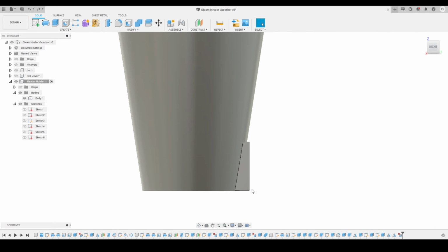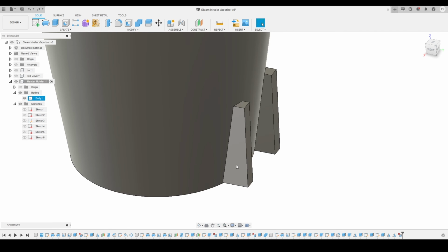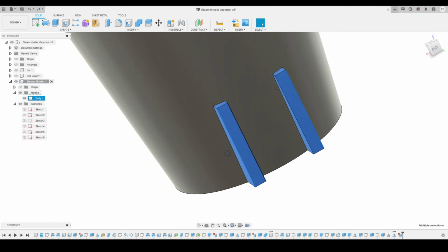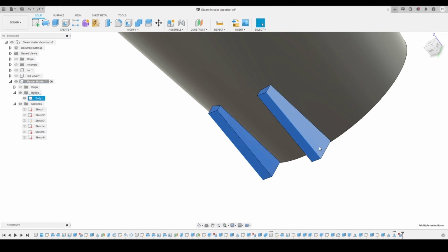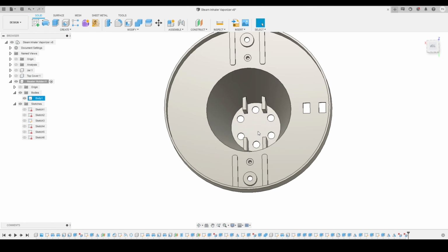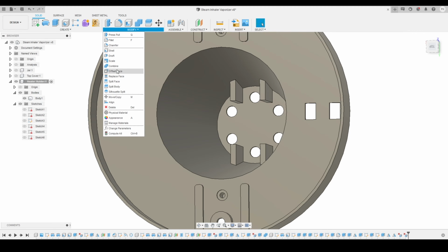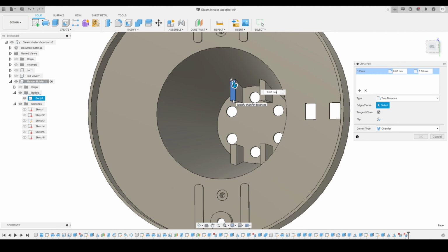So for that, I will zoom in a little bit. I will select the faces one by one by pressing shift on my keyboard, and then press delete. Here you can see I selected all the faces. Just be careful that you are selecting all the faces, and press delete on your keyboard. So here you can see this is the final shape we got. Now I will go into the modify panel, activate the chamfer tool, and apply chamfer on all these 4 corners.